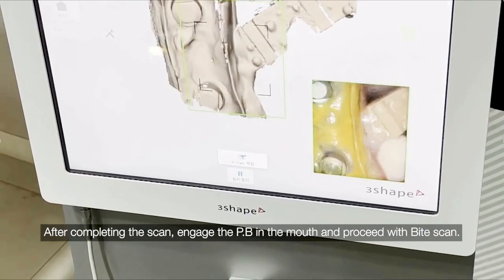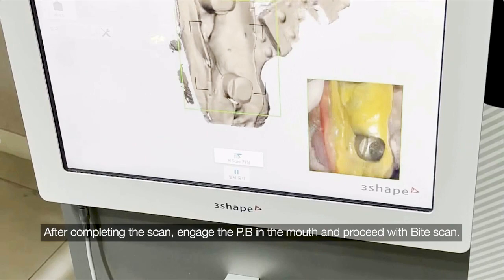After completing the scan, engage the provisional bridge in the mouth and proceed with bite scan.